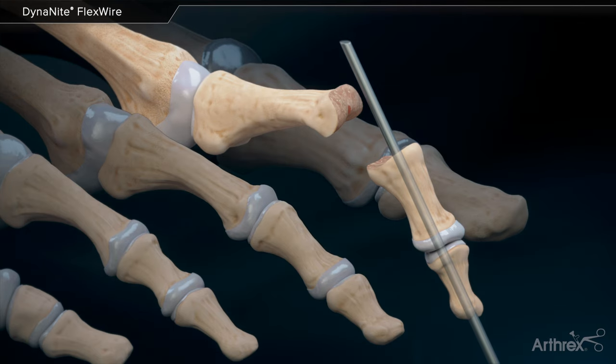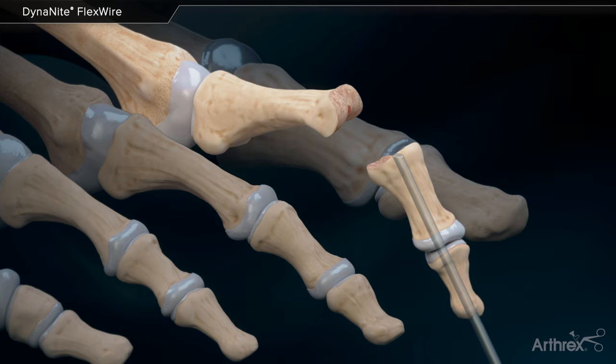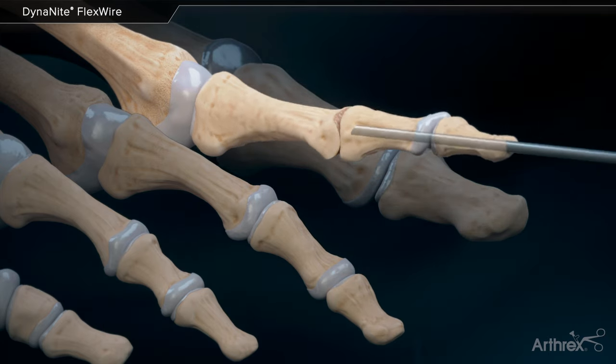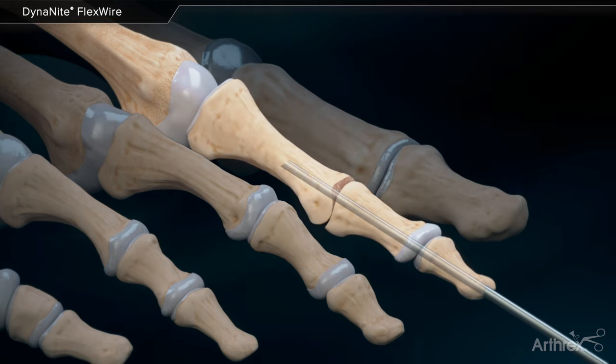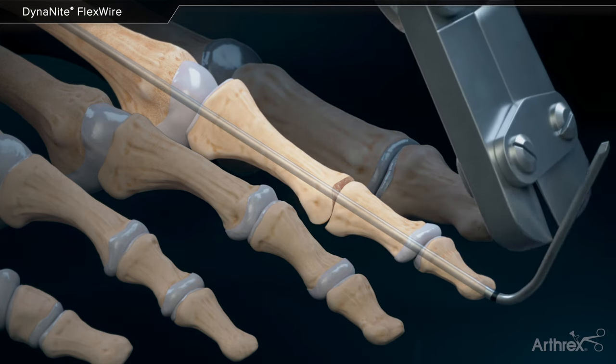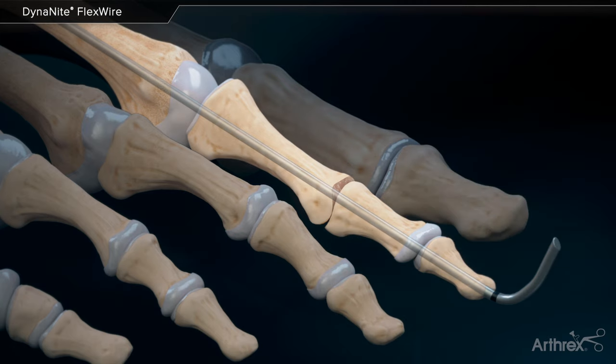Retract the flex wire into the middle phalanx and align the toe into the corrected position. Ensure the phalanges are in line with the metatarsal for flex wire placement across the MTP joint. The distal malleable portion of the wire left outside of the toe can now be bent, cut, and capped in standard fashion.